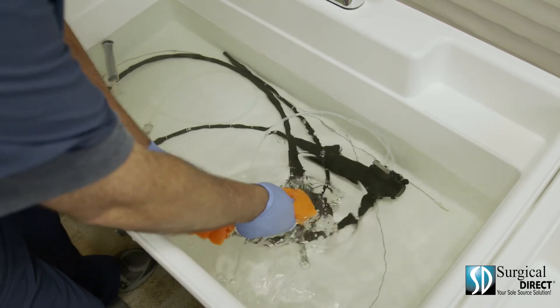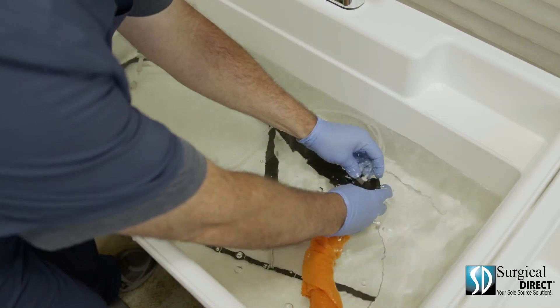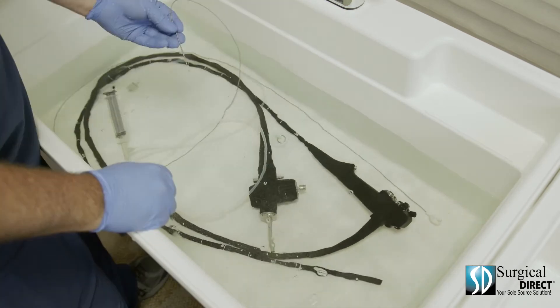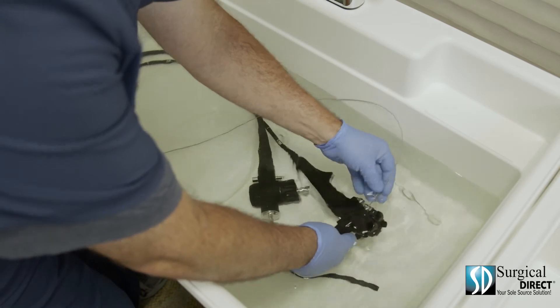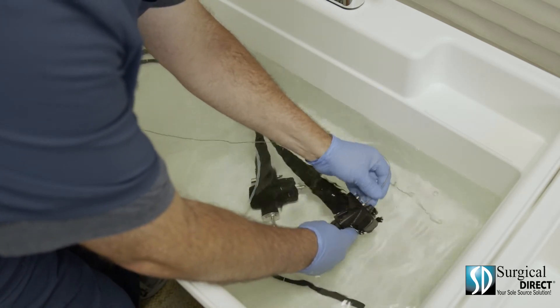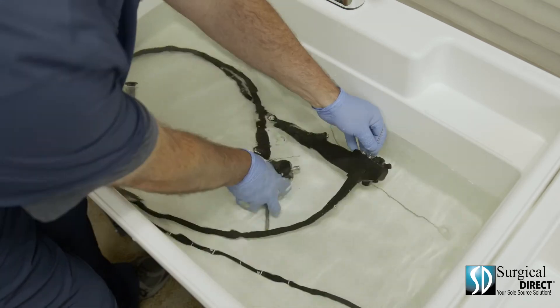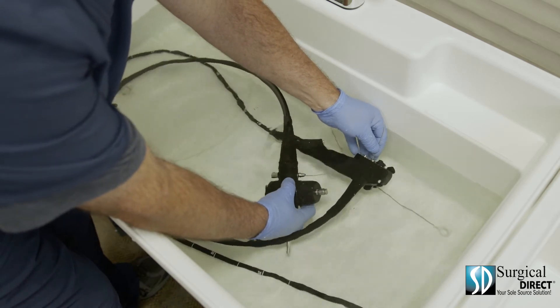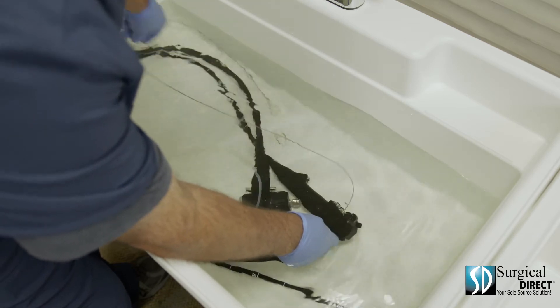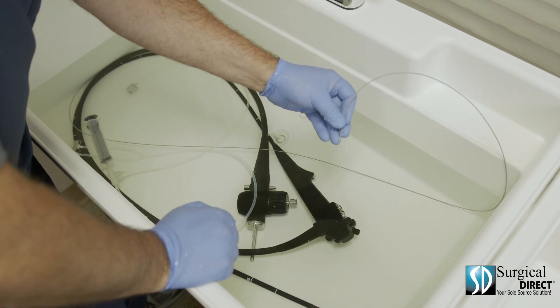Using a soft sponge, thoroughly clean all external surfaces of the scope. At this point, you can disconnect the automatic cleaning channel. Using the supplied cleaning brush, brush each lumen of the scope. Start with the suction and push the brush straight back through the scope. Advance the cleaning brush until it exits through the suction port. Be sure that the bristles are clean, then completely remove the brush. Brush this channel of the scope until the brush comes clean three times.